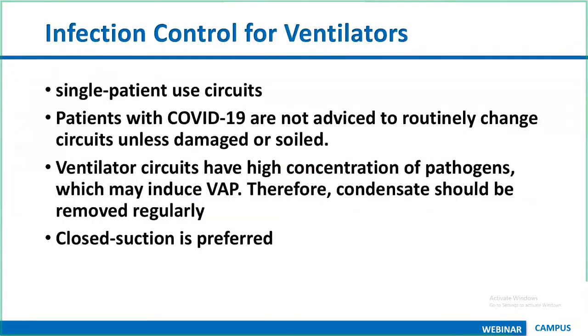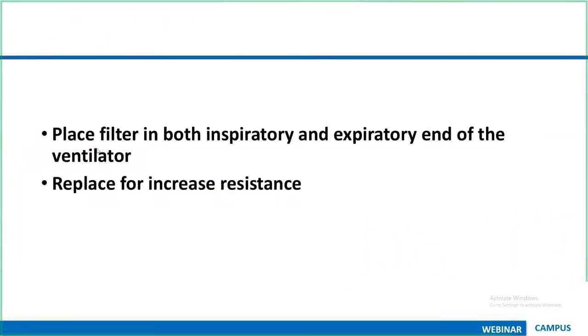Then you keep a little distance away from the patient. Then you connect all these gadgets. Otherwise, don't open the circuit when the ventilator is on, because there will be huge aerosol generation. You are likely to get infected. The closed suction is always preferred. I've already told you to place filters at both the inspiratory and expiratory ends of the ventilator.